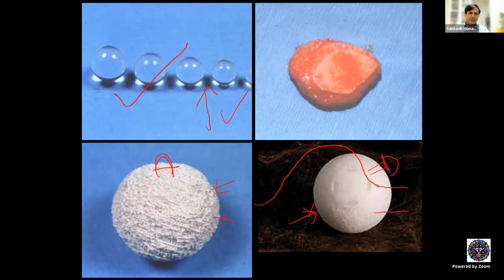If you don't peg it, the implant motility is comparable to myoconjunctival technique implant motility, and they give no additional advantage. So if a patient were to ask you a question, just by having a hydroxyapatite implant and choosing to not get it pegged, would I get better prosthesis motility? The answer is no. Unless the implant is pegged and the peg is coupled to a prosthesis, the patient will not get better prosthesis motility.